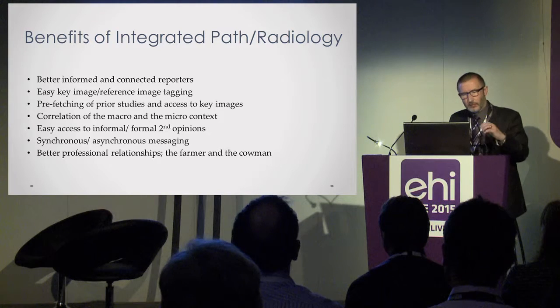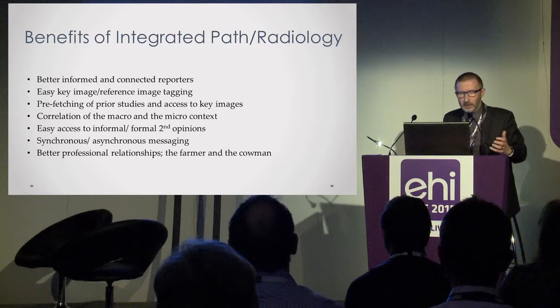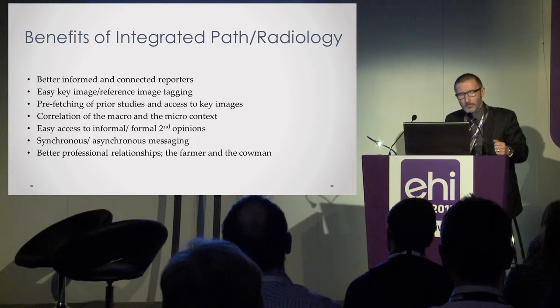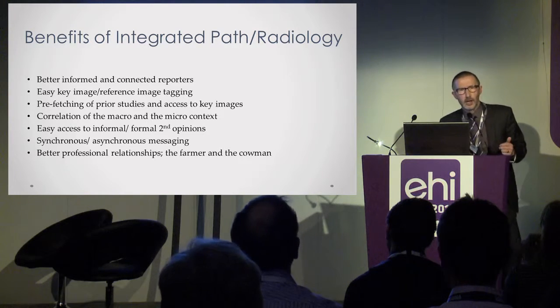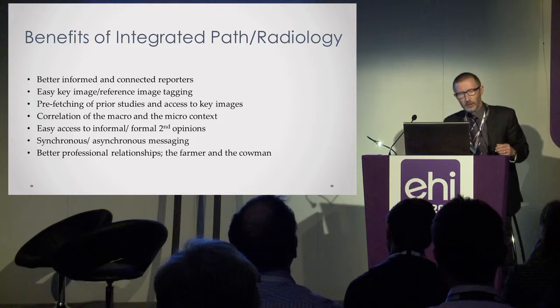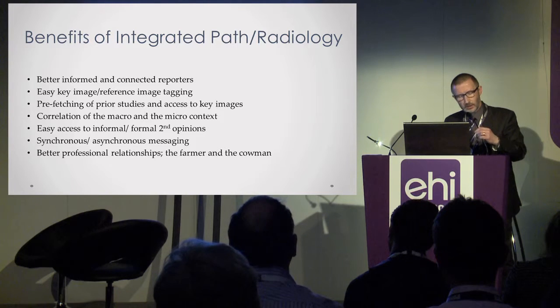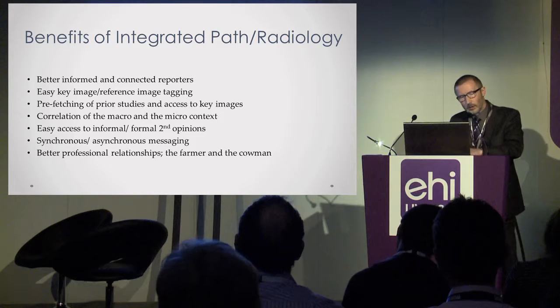Fundamentally, we're looking for better informed and connected reporters. We want this correlation between the macro environment that we see in imaging and the micro context that we see in pathology. We're used to it in radiology, easy key image and reference image tagging, but we want to offer that same easy facility to our pathology colleagues. Prefetching of prior studies and access to these key images is a real marker for improved quality in the reviewing and reporting process.